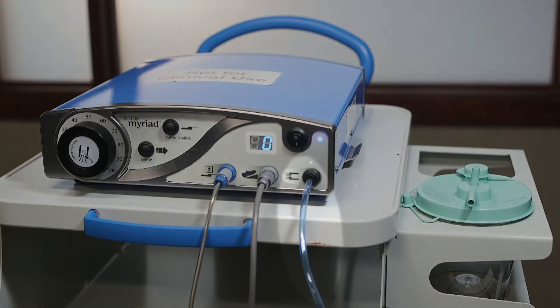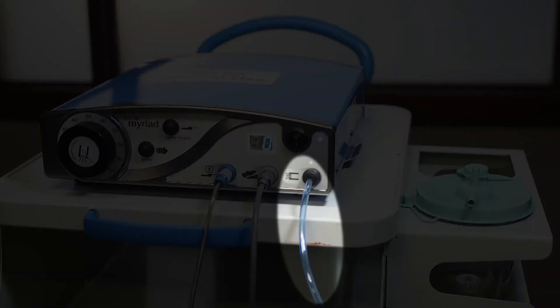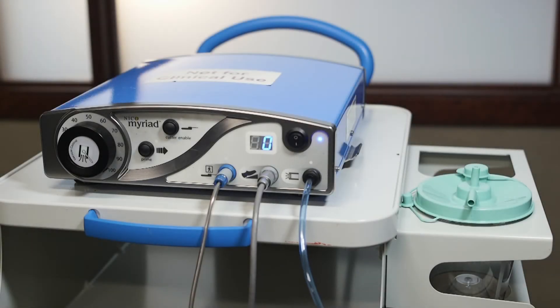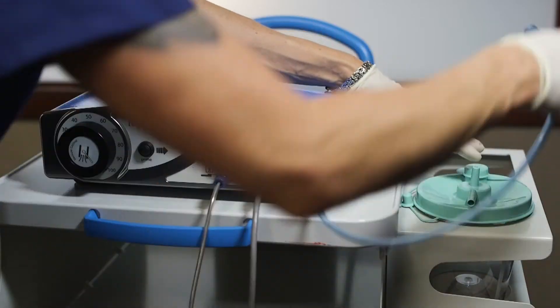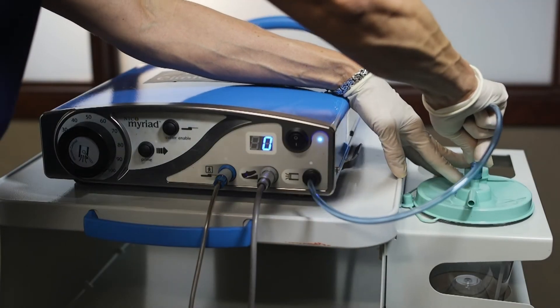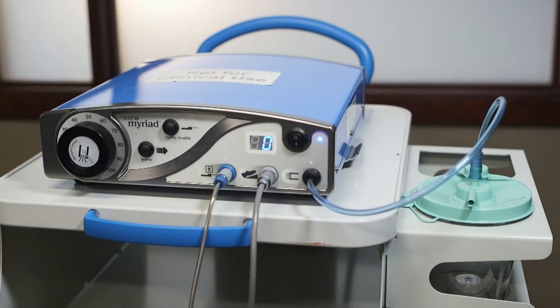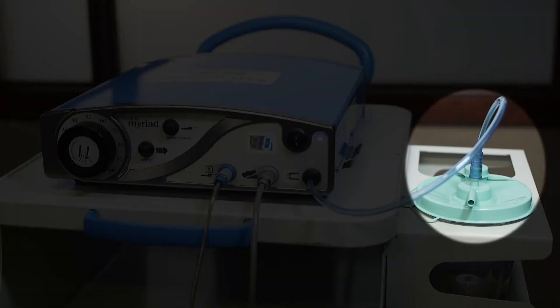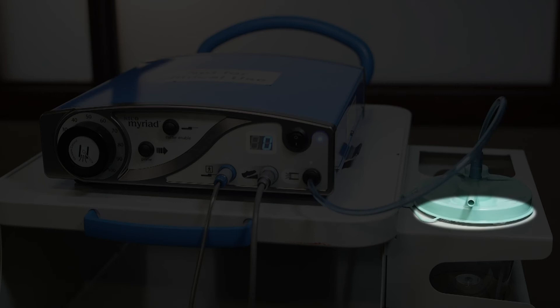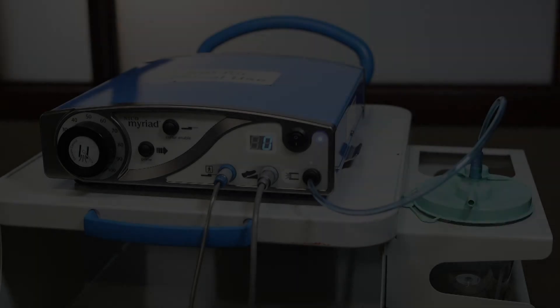The console includes a flexible blue aspiration line that exits the front of the console. The opposite end of the aspiration line includes a flexible suction connector that is attached to the vacuum port on the top of the canister. Ensure that the lid and port caps are secure and sealed to avoid vacuum system leaks. Any leaks in the aspiration system will affect the performance of the Myriad.